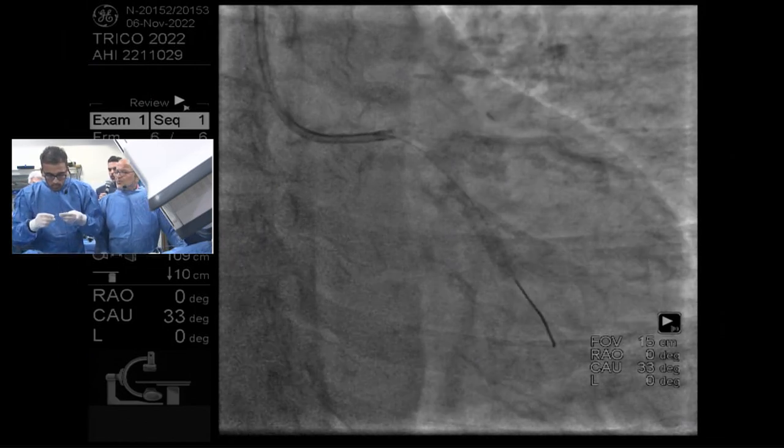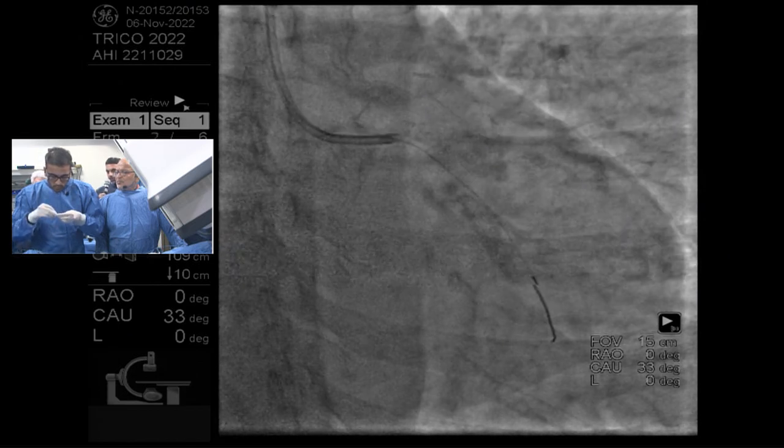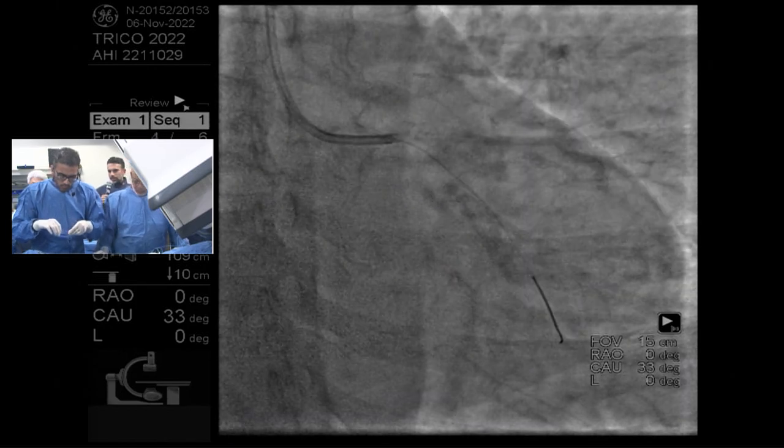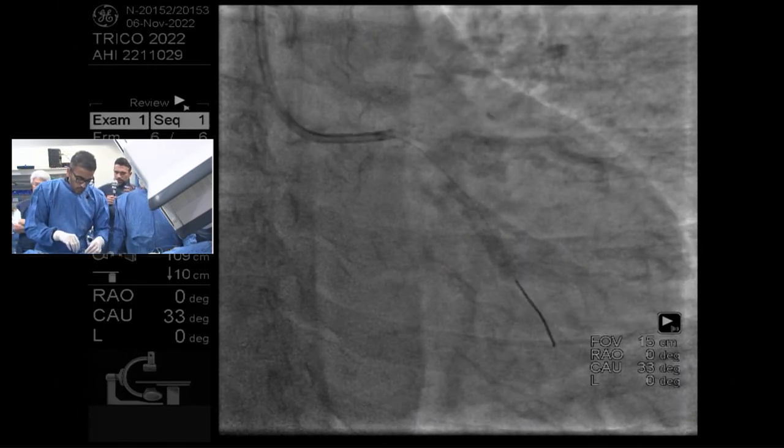You know, you have those odd left mains that are like cisterns, right? They're massive cisterns where they're almost non-existent, they're almost separate ostia. That's a different beast than this, where you have a defined left main here.